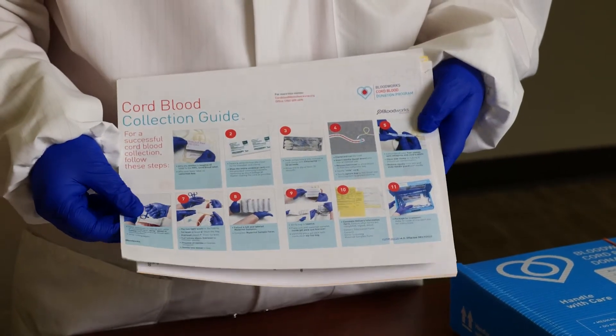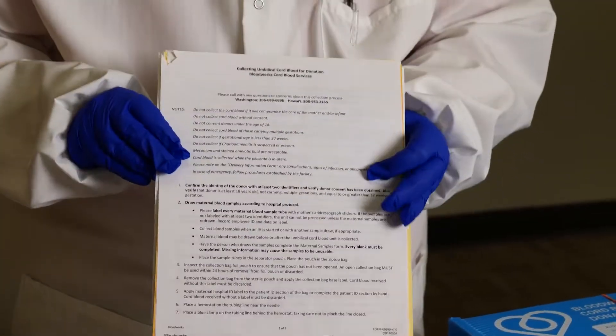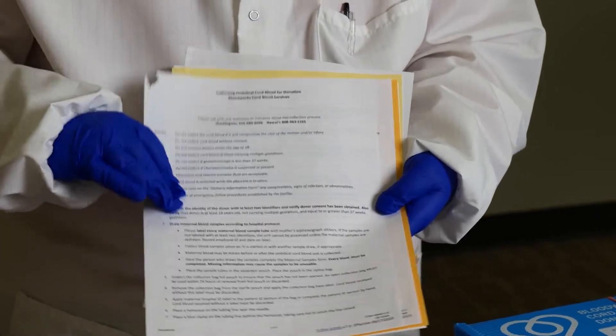Inside the Admit Packet, there is a collection guide in case you need a refresher on how to do the collection. There are also written instructions if pictures are not quite your speed.